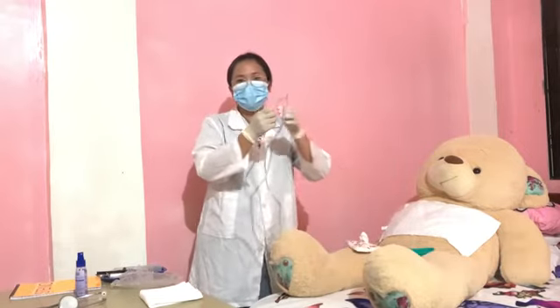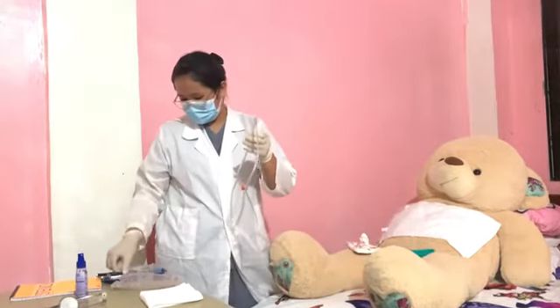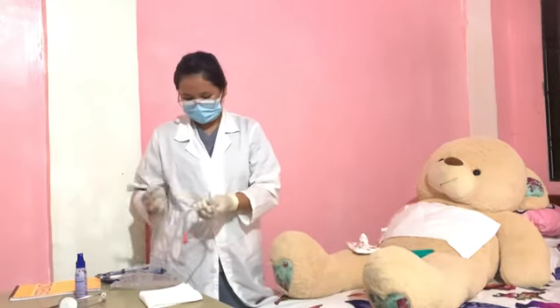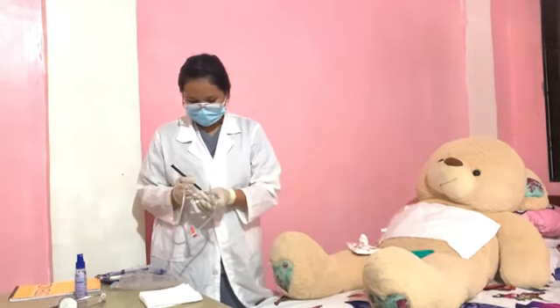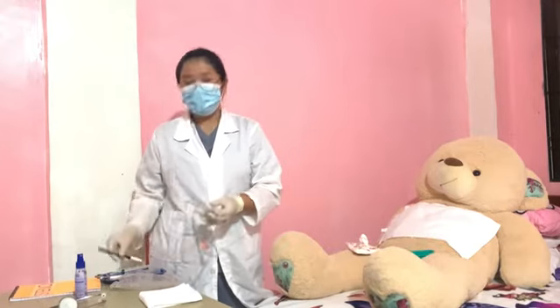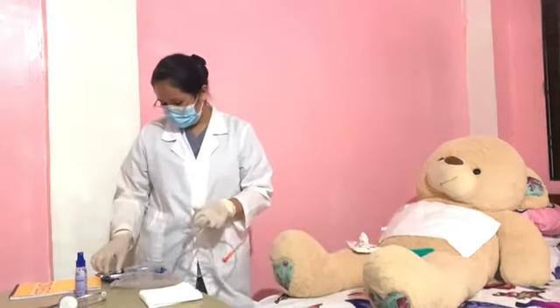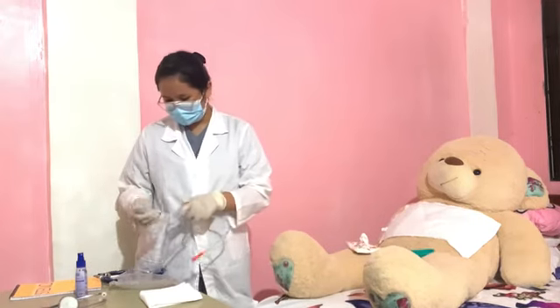And then mark the tube with a marker. And after that, lubricate the tip at least 2 to 4 inches with water-soluble lubricant. This is to make sure that the tube will slide in easily.